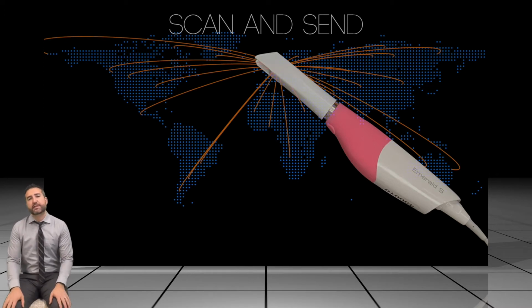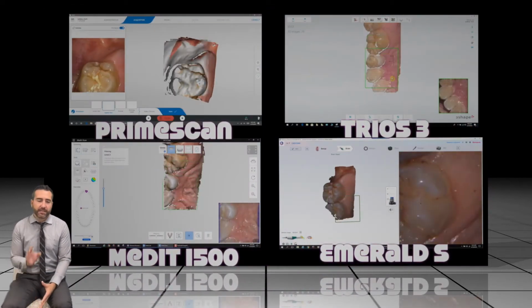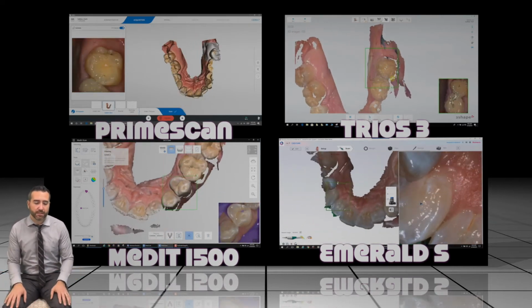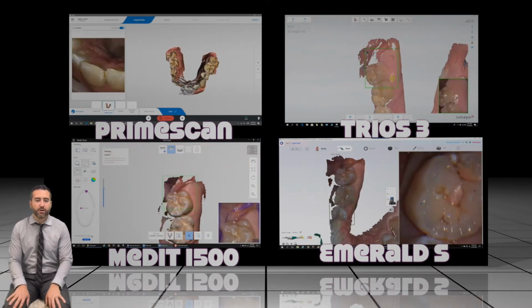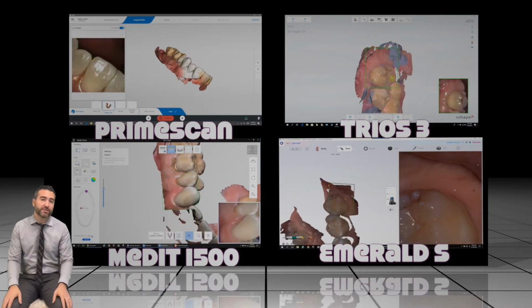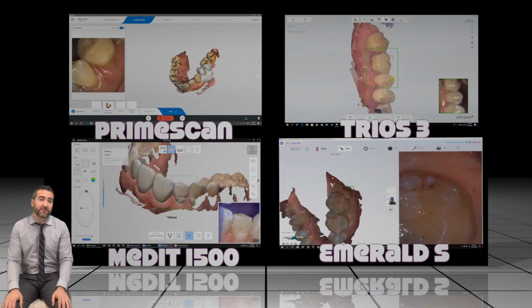The first thing that we're going to discuss is scan and send. So in this concept, we essentially don't have a mill in the office, and we're scanning our patients, and we're hitting a button and sending these scans through a HIPAA-compliant network to your favorite laboratory. And maybe this is a good starting point because, as we see here, every scanner is essentially a rotational-based full-color scanner. They're all mostly open these days, and I have to tell you, it doesn't matter which one you get, they're all phenomenal.